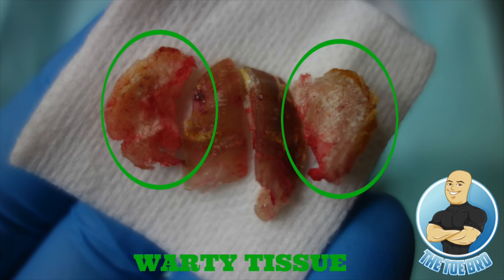Now, on either side of the nail, we can see the large warty pieces, the capsules or encapsulated tissue that I removed. These were the main pieces of tissue that I clipped off, but there was a lot more that I scooped up and pulled out.